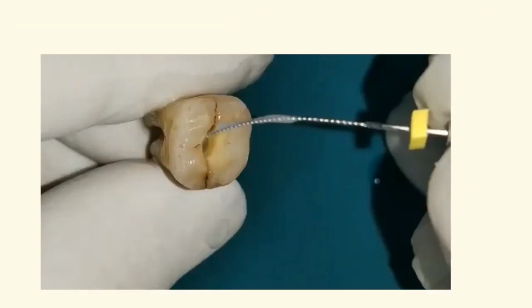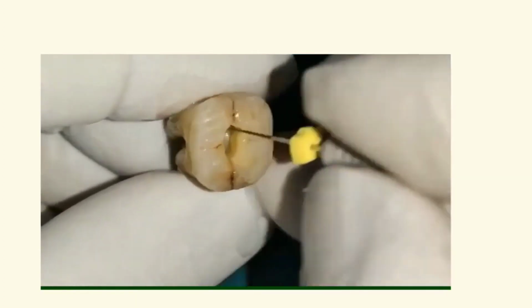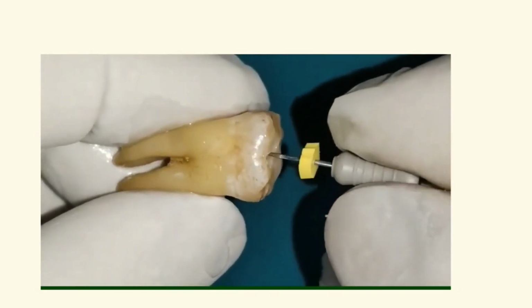It is usually done with the smallest hand file like a number 8 or 10 K file depending on the initial canal width. Maximum time should be spent on this step. This is a small video showing the procedure of following the canal to the radiographic terminus. The chamber must be generously irrigated with sodium hypochlorite.